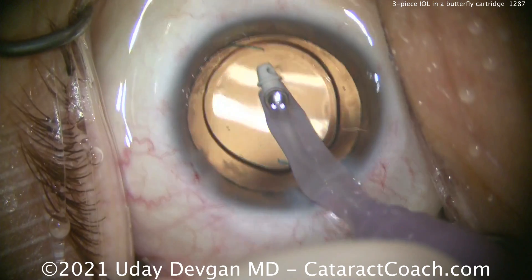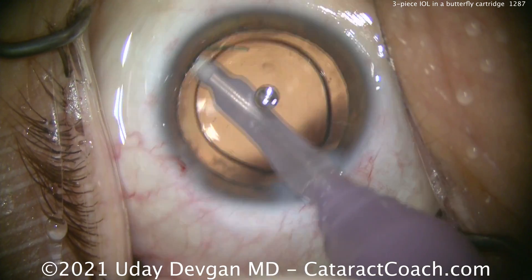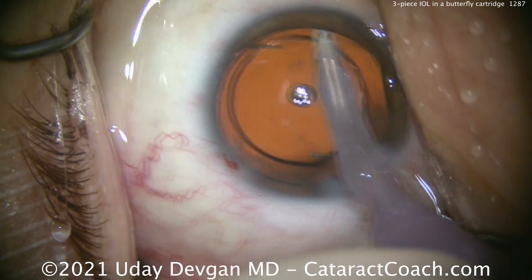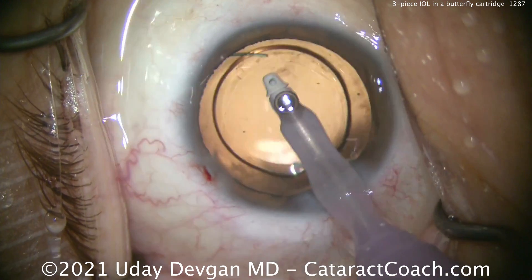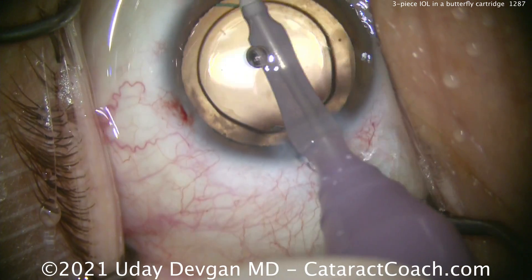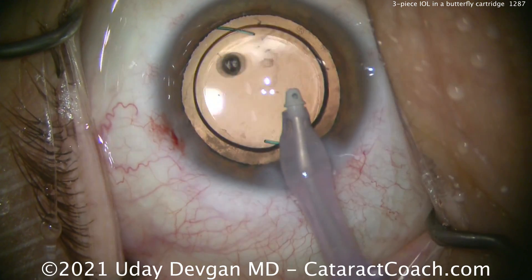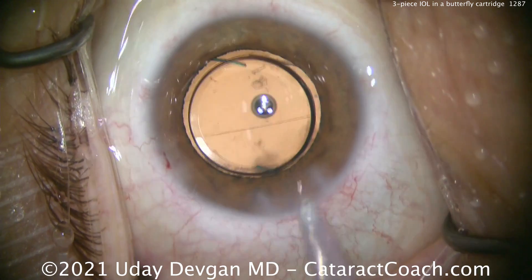It does work as long as you're using a three-piece acrylic hydrophobic lens with another three-piece acrylic hydrophobic lens, though manufacturers obviously don't recommend that. At the end of the case, polishing up the capsule bag is much easier once you already have the IOL in there to protect the capsule. This AR40 lens is a very nice lens — actually great for ultra-myopia patients, available up to minus 10 diopters in power.